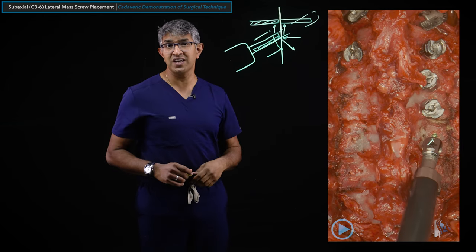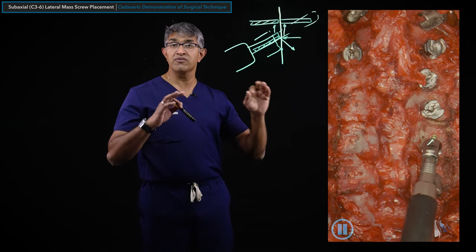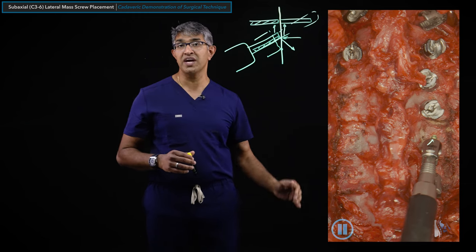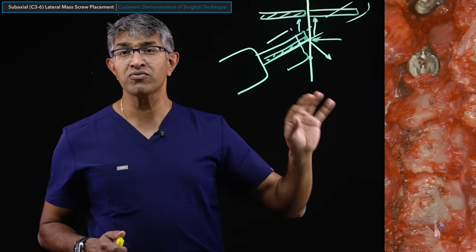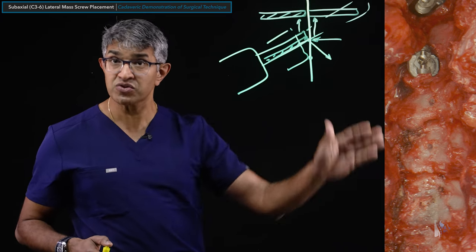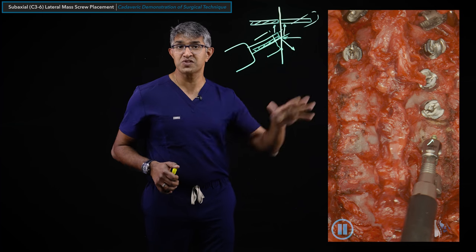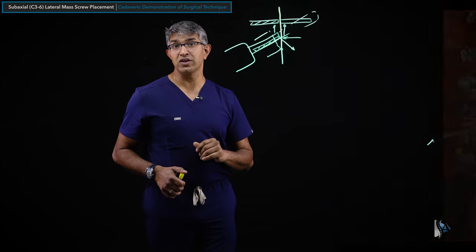I use this same sequence on both sides - typically running all four on one side, then the other. With a very able assistant, you can alternate: three, three, four, four all the way down, which requires good workflow coordination. These are incredibly efficient screws to place - you can instrument four levels in about 20 minutes with a good technique and workflow.